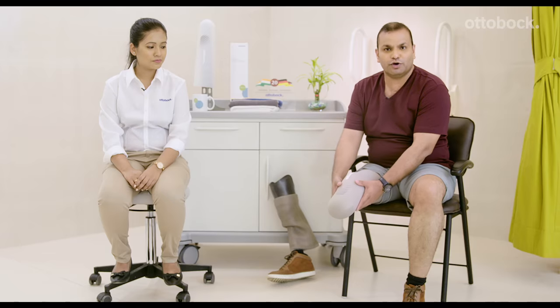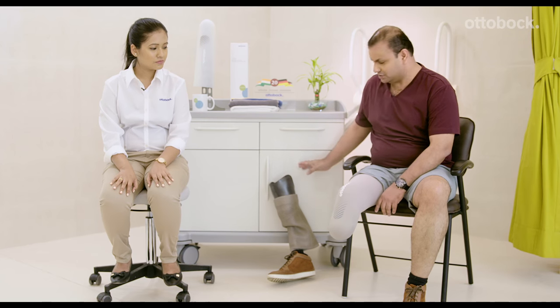If you feel that some amount of air is trapped in between the liner and the skin, you may find it uncomfortable during walking with the prosthesis. In that case, what you need to do is take off your liner and wear it once again. Once you have worn your liner on your residual limb, you can then proceed to wear your prosthesis.